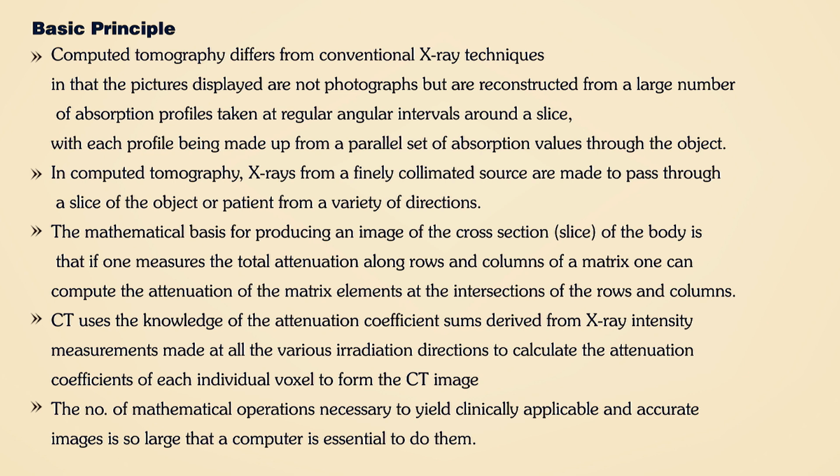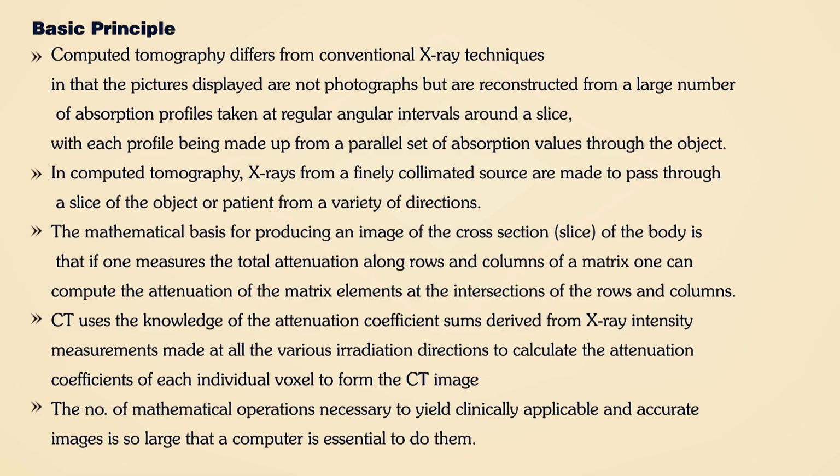CT uses the knowledge of the attenuation coefficient sums derived from X-ray intensity measurements made at all the various irradiation directions to calculate the attenuation coefficients of each individual voxel to form the CT image. The number of mathematical operations necessary to yield clinically applicable and accurate images is so large that a computer is essential to do them. So, the computer is a very essential part of the CT imaging system.